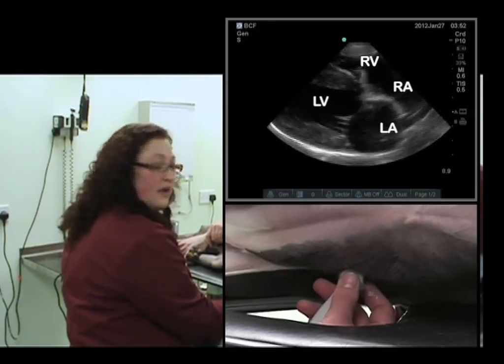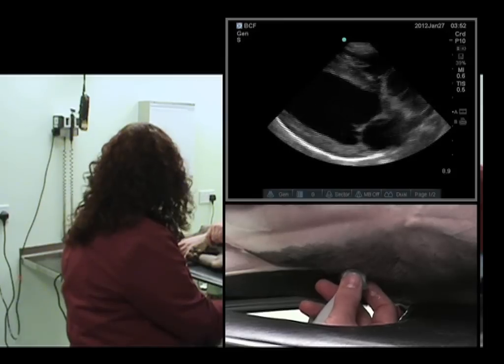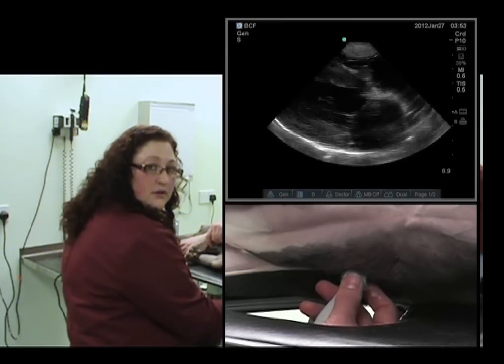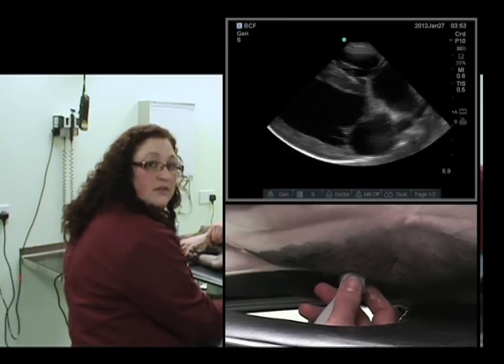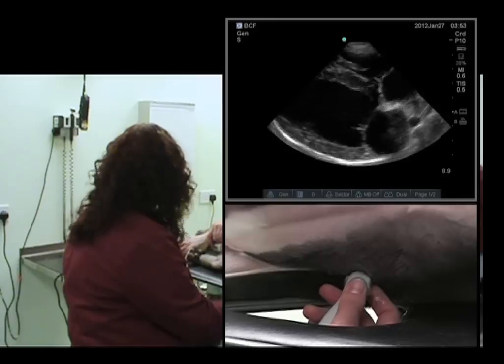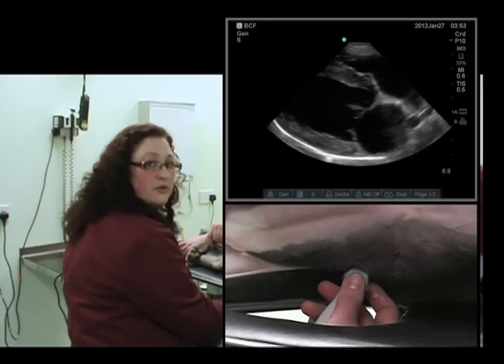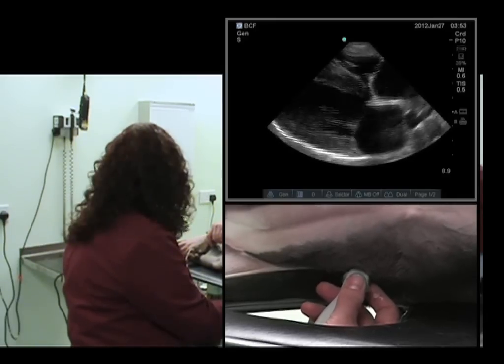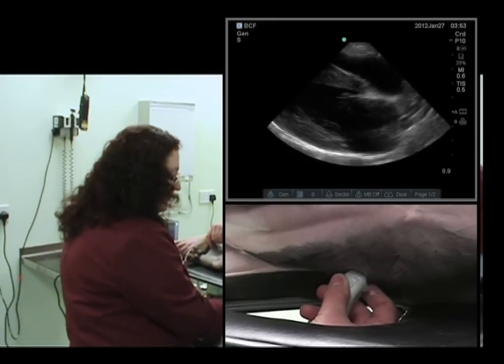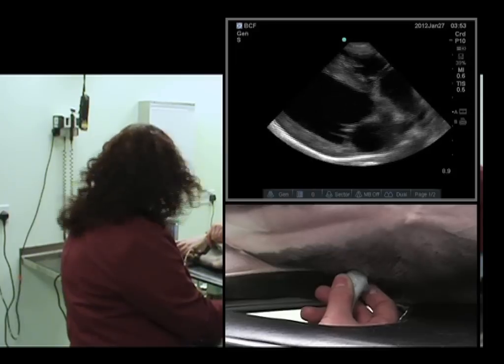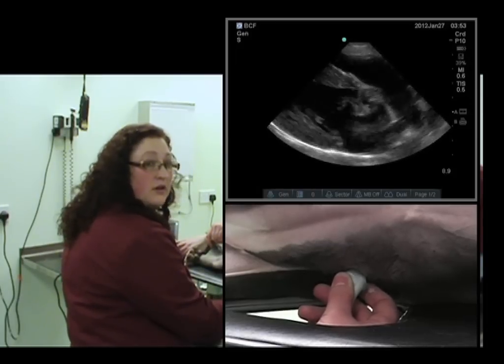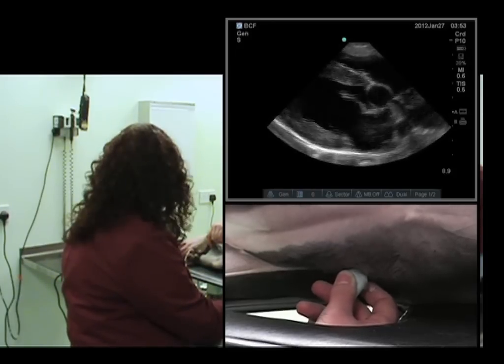What we now need to do is actually rotate even further in the anti-clockwise direction to obtain our short axis view. We'll rotate, always watching the screen and making very small movements.